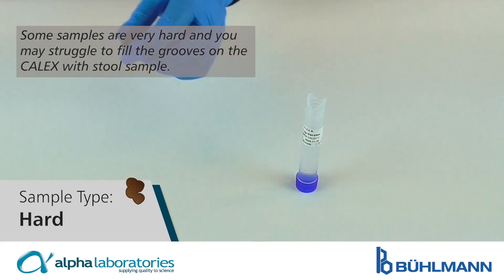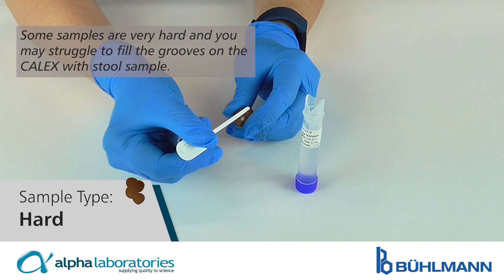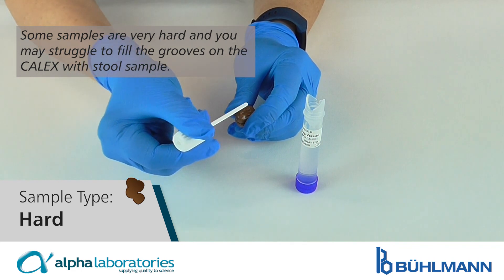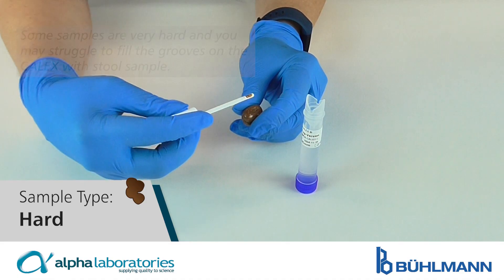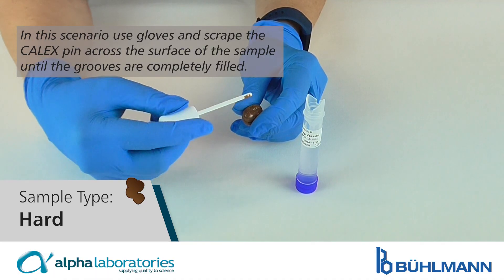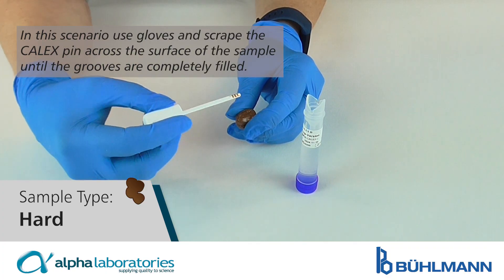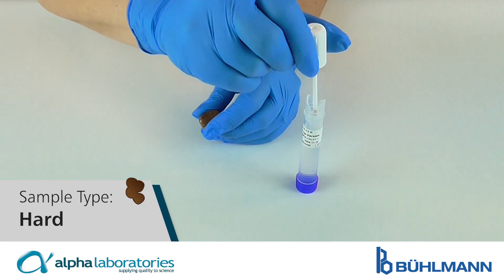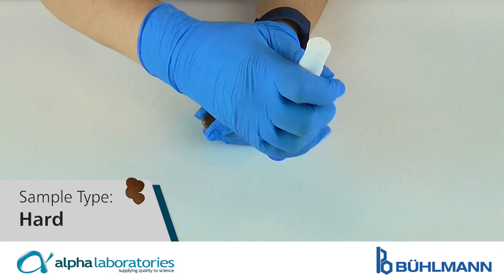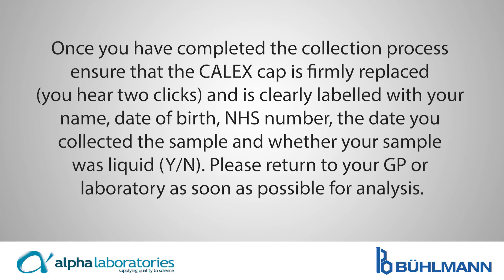Hard samples. Some samples are very hard and you may struggle to fill the grooves on the CALEX with the stool sample. In this scenario, use gloves and scrape the CALEX pin across the surface of the sample until the grooves are completely filled.